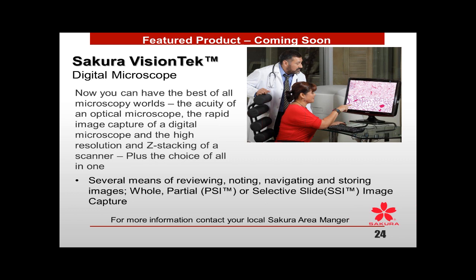It really is dependent upon the different vendors and how they scan. Most of them get rid of the white space now, so the digital scanner can quickly identify just where tissue is and scan only tissue, not the whole slide and all that white space. But you can go from a couple of minutes to multiple.